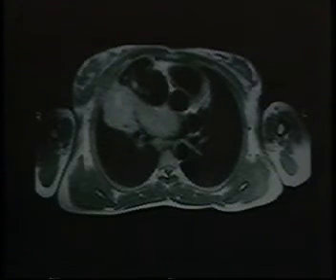At the time of surgery, this was totally free in the left atrium. There was some infiltration of the pulmonary vein near its orifice to the left atrium. The surgeon could do a wedge resection of the vein. The total mass was delivered with the tumor. Now, I'm not saying this is a cure, but this is 6 months later. The patient has no evidence of tumor in the chest.